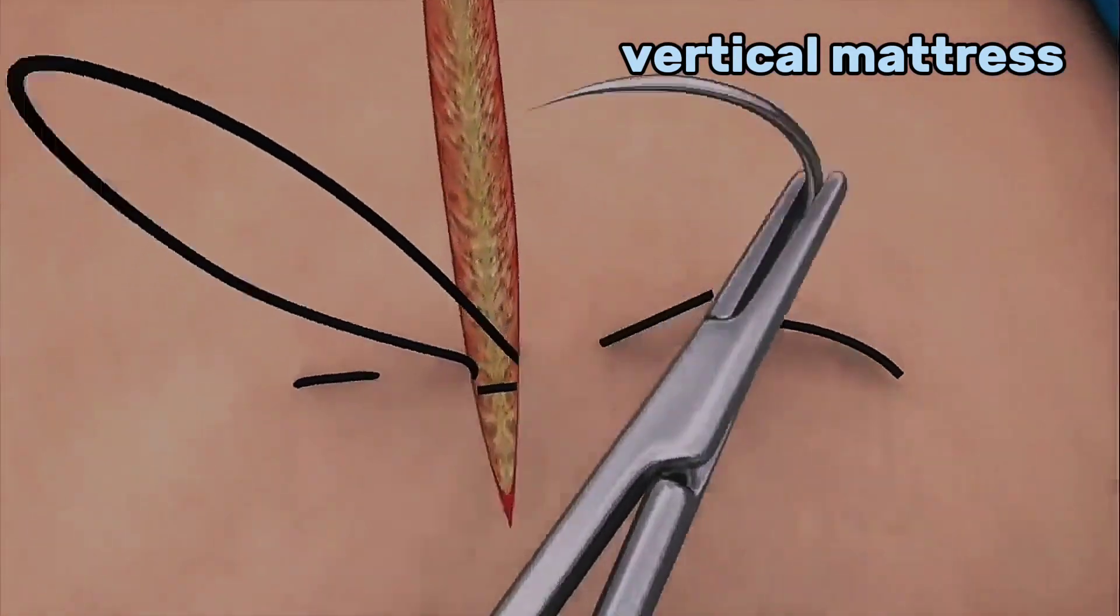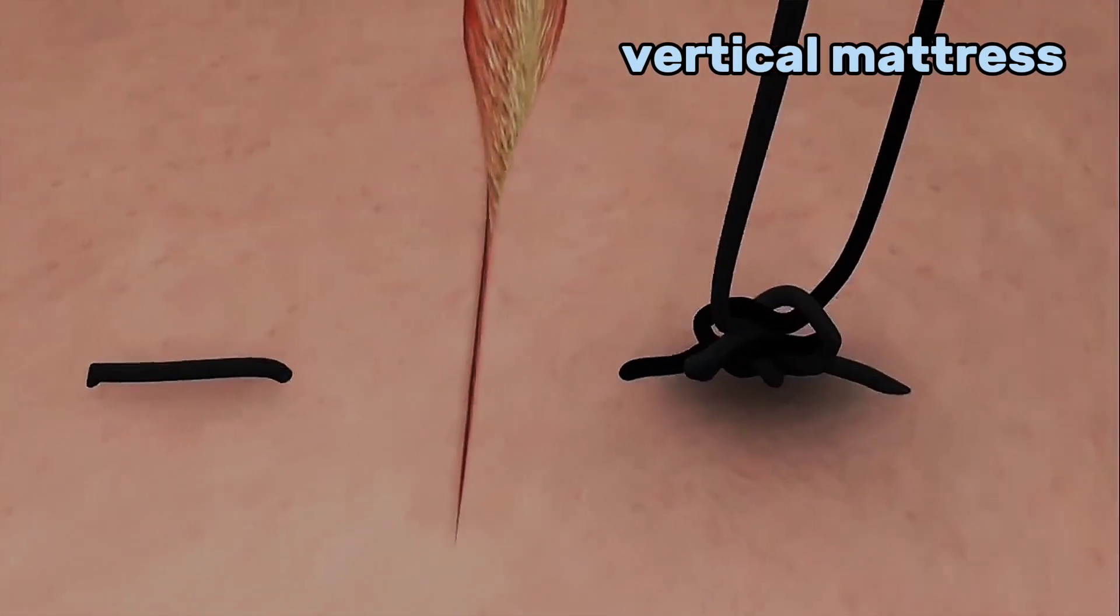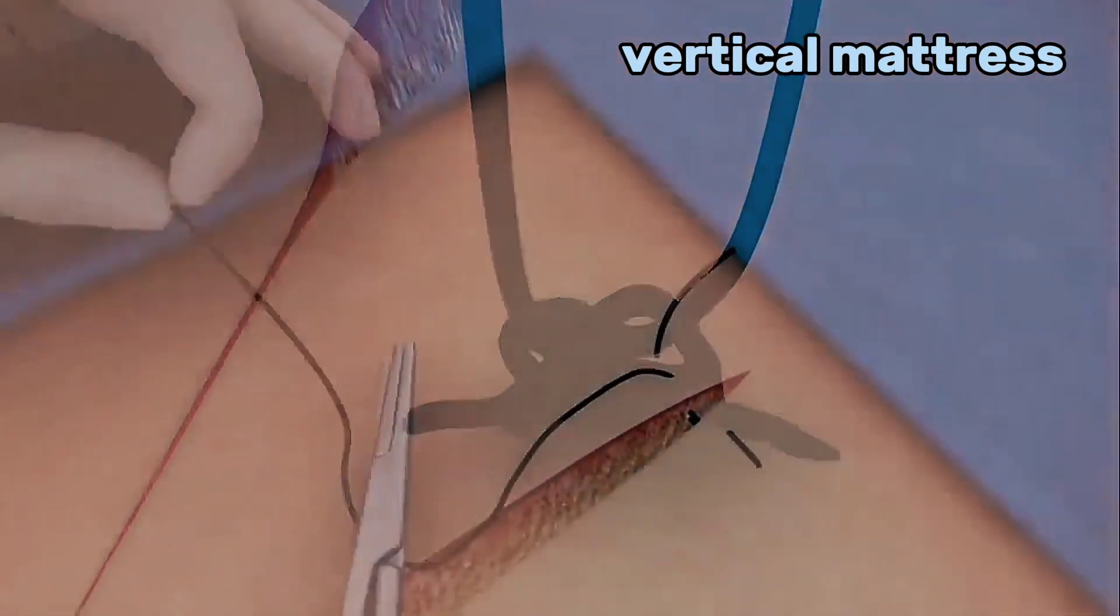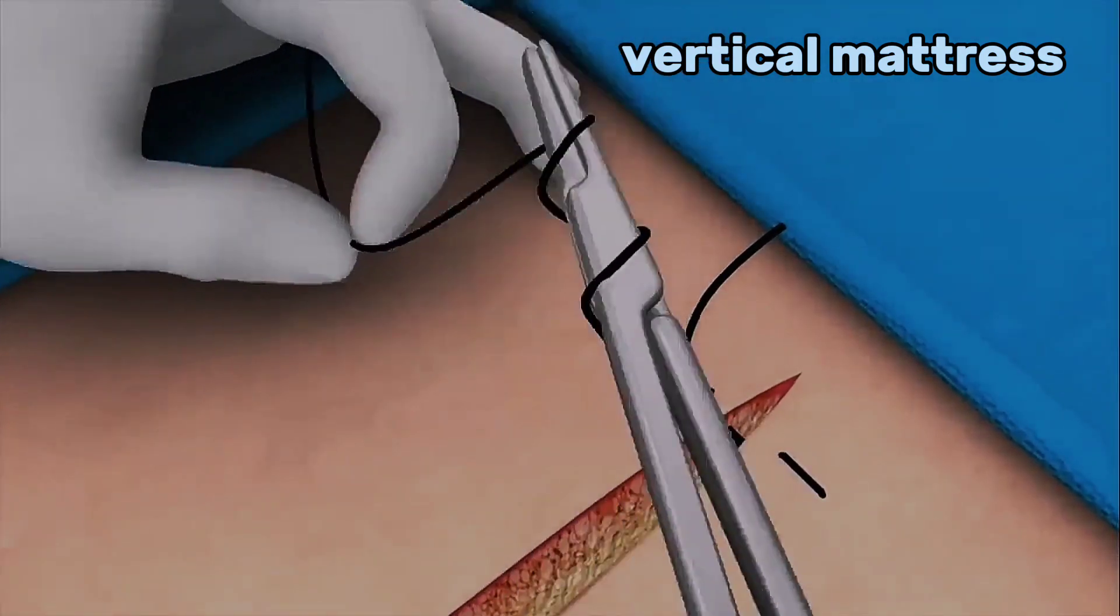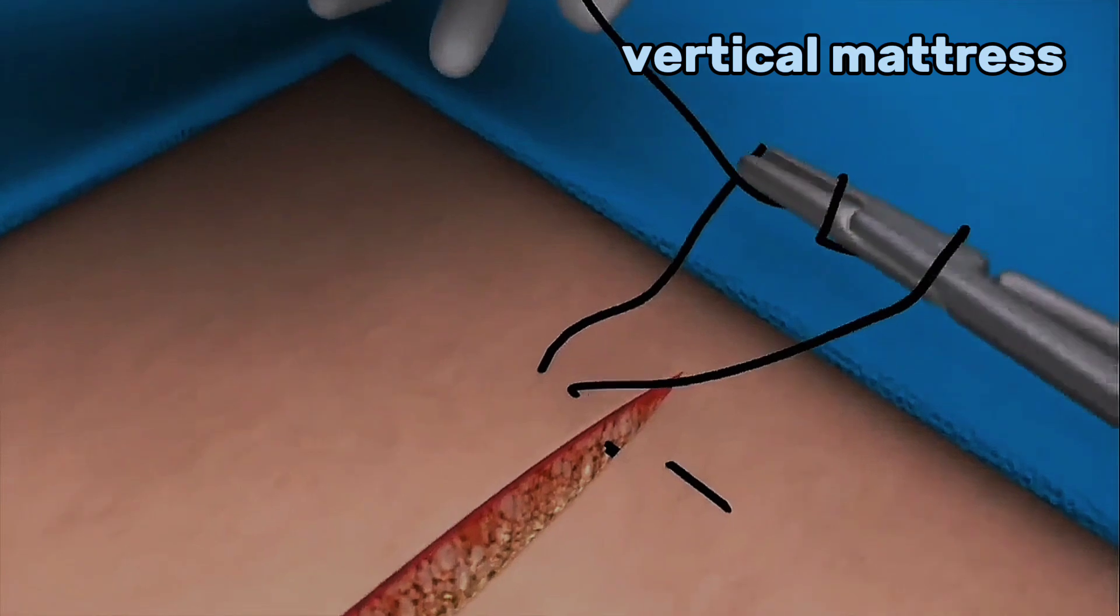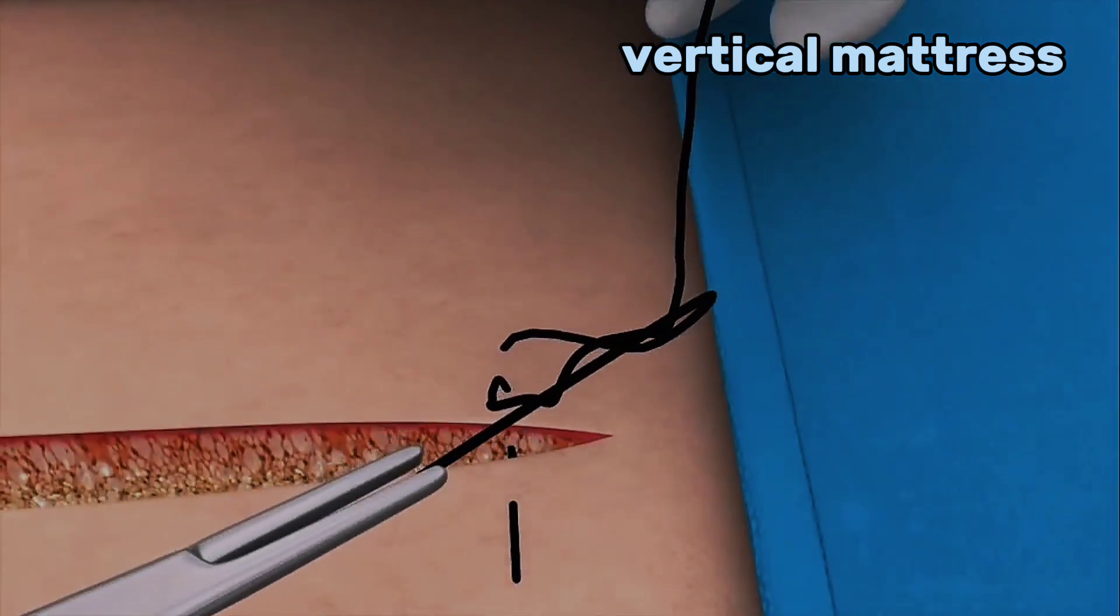Pull the suture through and tie a standard knot without excess tension. When tying the knot, make a double forward throw first by wrapping the suture twice around the tip of the needle holder. Grasp the end of the suture with the needle holder and pull it through the loops as shown.